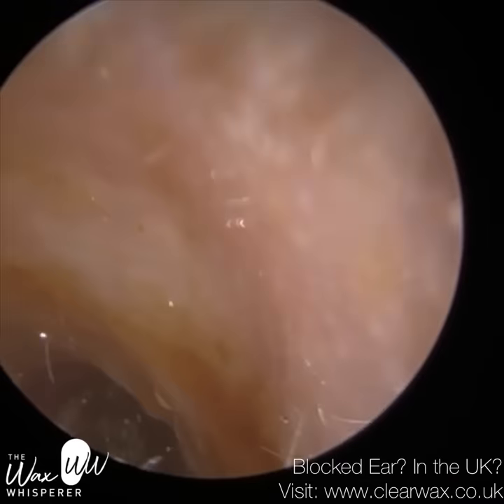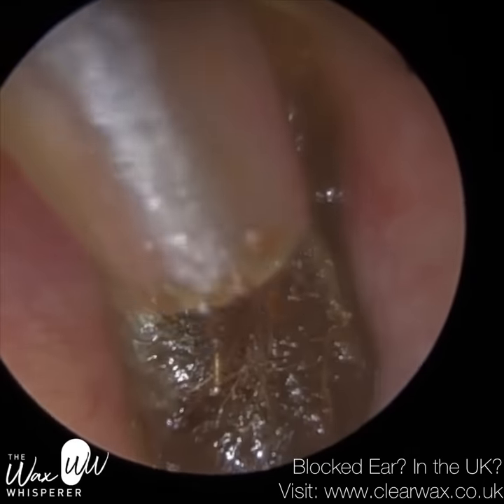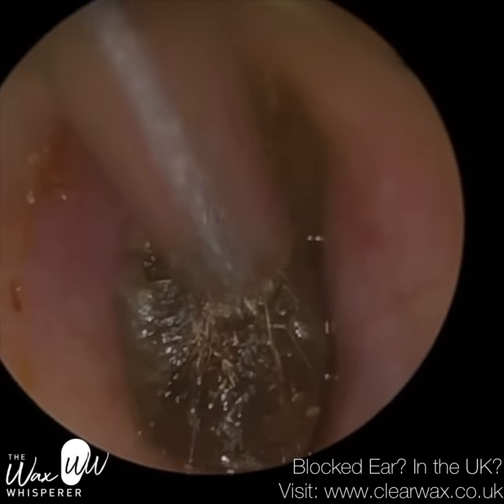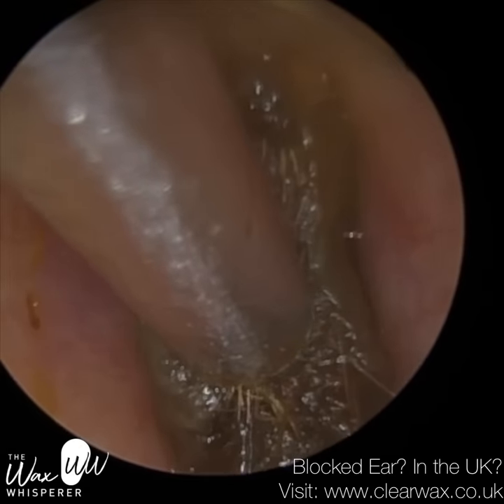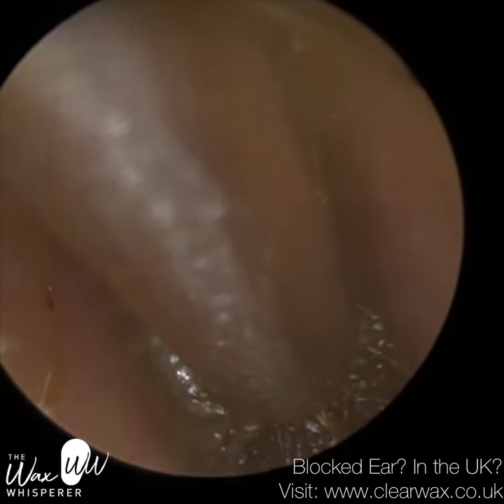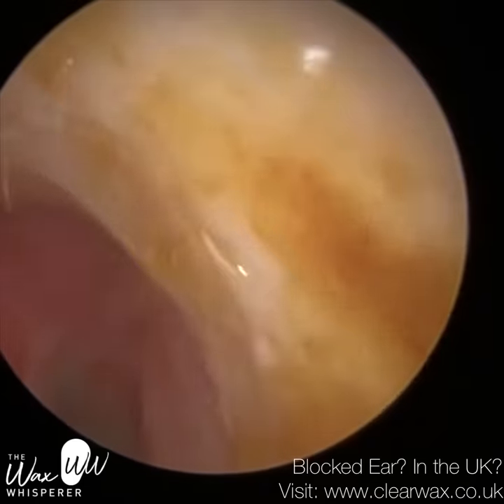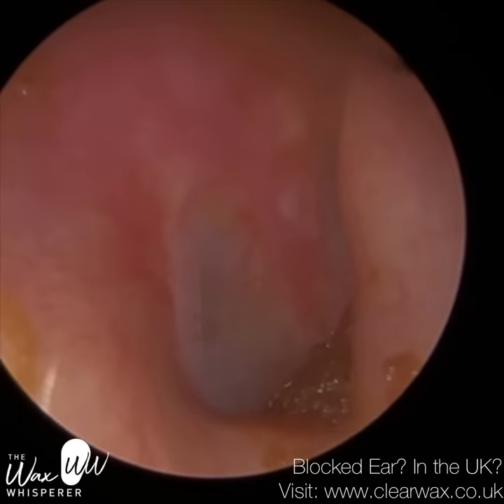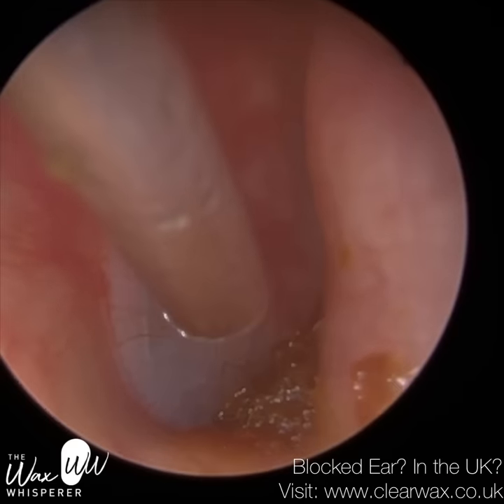With an endoscope, I didn't realise how difficult it would be to train and for others to acquire that skill. It is a very difficult skill, and I appreciate that a bit more now, to train people to use it. And that's because you need a lot of bilateral integration. You're having to use both hands simultaneously, as well as your eyes. You can't see it because you're inside the ear, but the left-hand side tip of the endoscope is being used to stretch the ear canal open and wide open and to straighten the ear canal and also to visualise the wax. And simultaneously, I'm then using my right hand with the instrument. So you constantly have to make little fine motor movements with both hands, and they have to be in synchrony. And if not, obviously it's a very difficult procedure to learn.